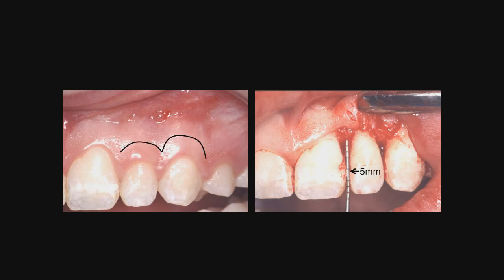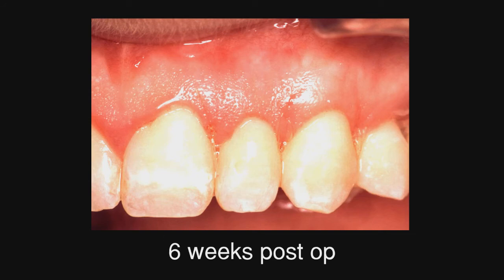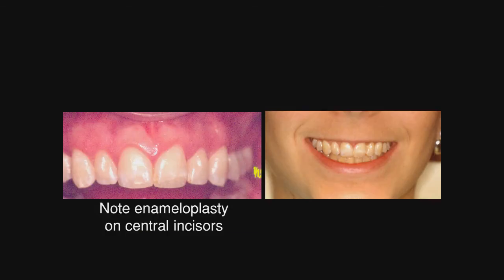I went ahead and flapped the tissue, removed the interdental tissue, but you will notice that from the crest of the bone to the contact point is 5 millimeters. And Tarnow says that that papilla will come back. Now let me tell you, that was gutsy on my part on about a 16 or 17-year-old girl in 1996. So here it is the day of surgery, and you will note the black triangle. I was very anxious to see her, and when she returned in 6 weeks, look how much this papilla had come back. So this case, in my opinion, proves that Tarnow's conclusions in 1992 were correct.